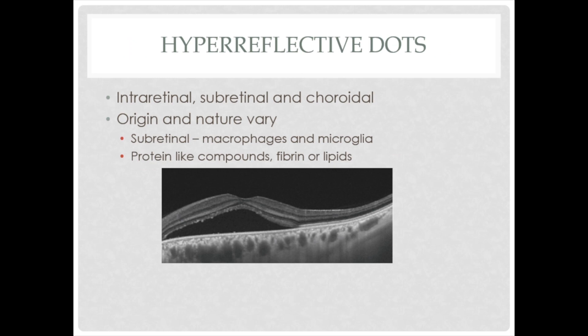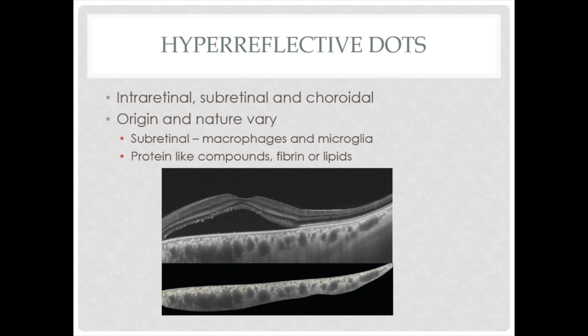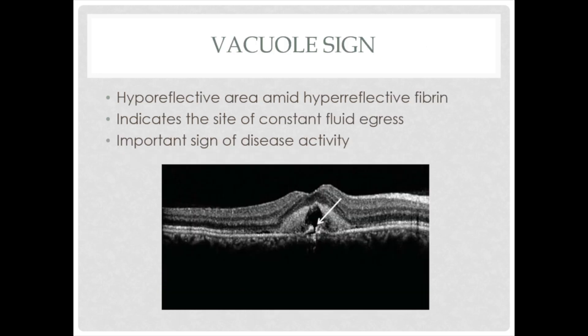Hyperreflective dots are deposits — hyperreflective spots which can be seen in intraretinal, subretinal, or choroidal areas. Their origin may vary. Subretinal hyperreflective dots are said to be due to macrophages and microglia engulfing elongated photoreceptors, or can be protein-like compounds, fibrins, or lipids. Subretinal HRDs are seen in long-standing cases and suggest a low final visual acuity. Another sign seen is the vacuole sign — a hyporeflective area amid hyperreflective fibrin, indicating the site of constant fluid egress and an important sign of disease activity.